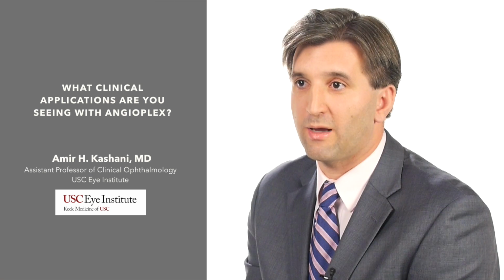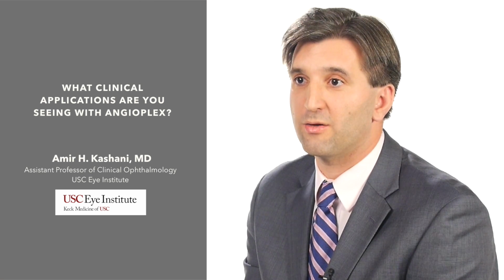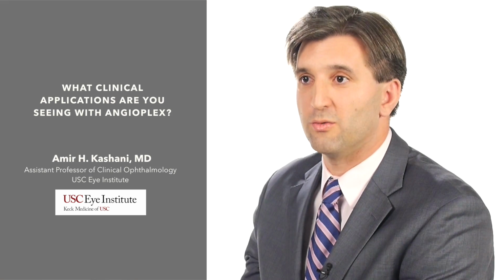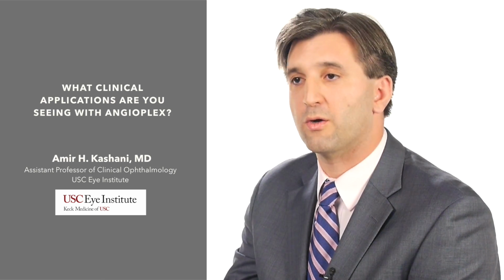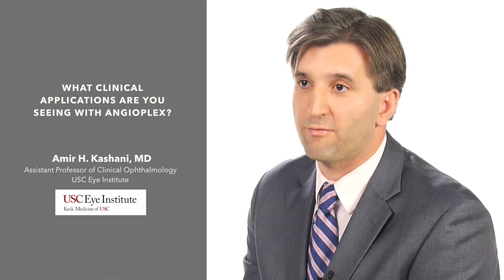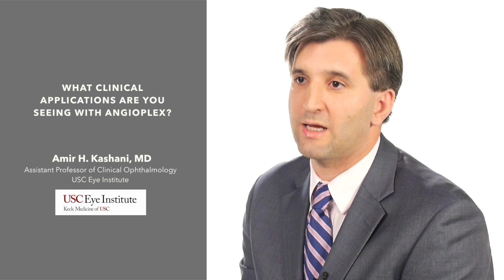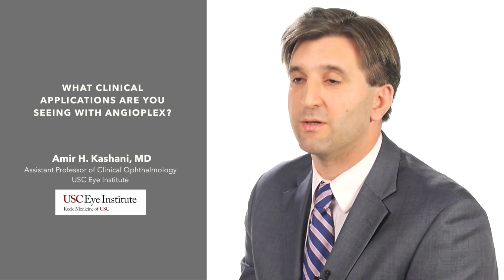Well, now when we have OCT angiography and AngioPlex, we can easily see the extent of the macular non-perfusion or the macular ischemia. And sometimes if we know that there's macular ischemia, it'll affect the way that we decide whether to do an injection, whether to follow a patient more closely, or whether to just tell them, look, we're going to try to do this treatment and it may not improve your vision as much because there's not enough blood flow there to support the visual function that we know you need. So there's a couple of different examples where people are using OCT angiography to change the management of their patients.